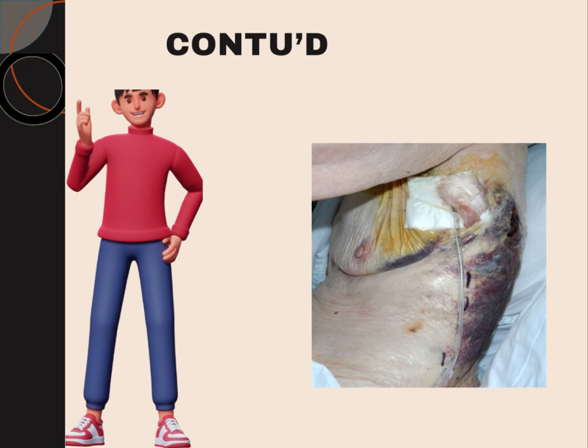So secure the drain with proper stitches, with proper dressing, and daily dressing removal, and look at it to see if it needs proper redressing, or needs to be cleaned, or needs to have the drain repositioned. It is a very important thing to keep in mind.